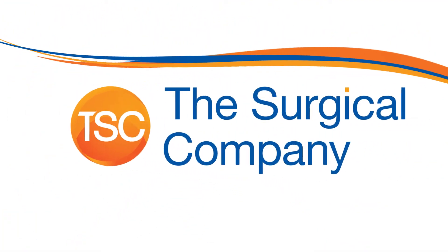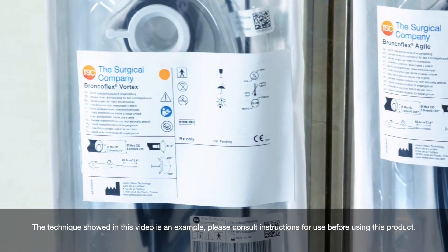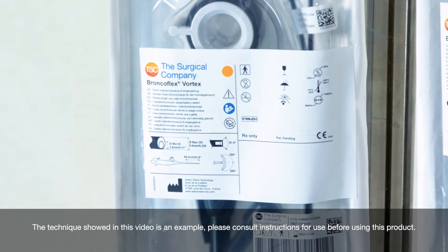The technique shown in this video is an example. Please consult instructions for use before using this product.